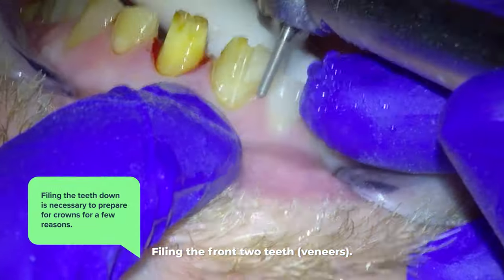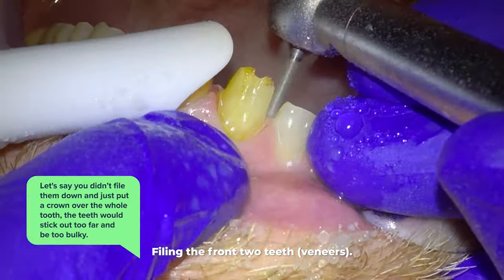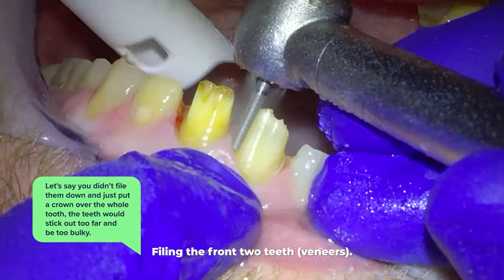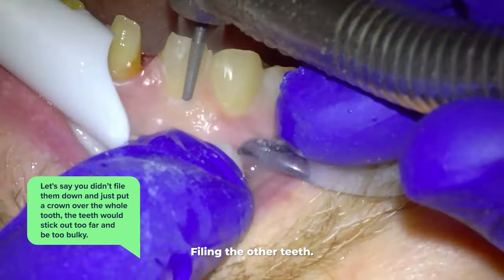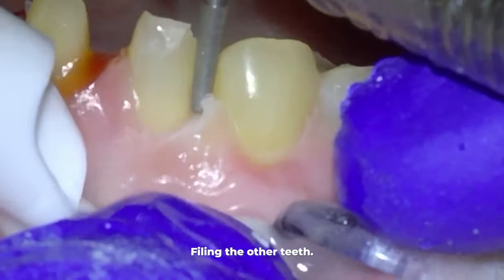Filing the teeth down is necessary to prepare for crowns for a few reasons. If you didn't file them down and just put crowns over the whole tooth, the teeth would stick out too far and be too bulky. This patient's front teeth already overlap the lower teeth too much — that overlap is called an overbite.